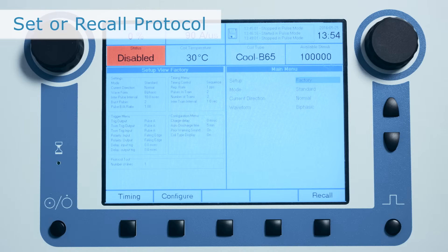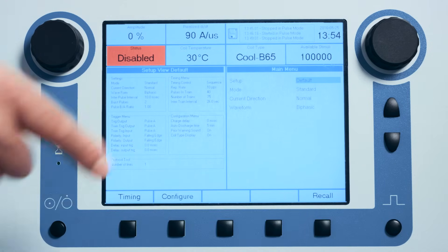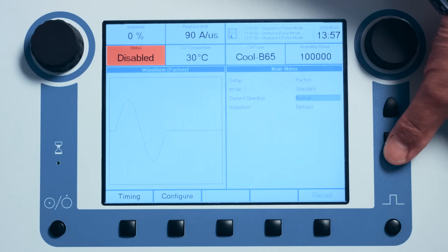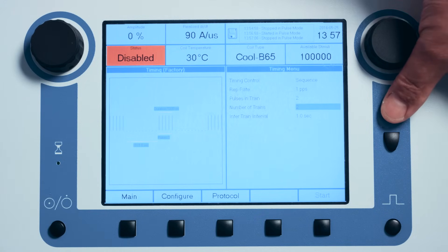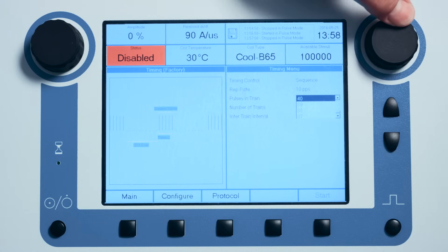If the stimulator does not boot up with the default protocol loaded, one can either recall it or define it again. To recall a protocol that has previously been defined and stored, from the main menu use the pulse wheel to select the protocol to recall, then depress the Recall soft key. The recalled protocol is now loaded and information about it is displayed in the setup view window. To define a protocol manually, confirm that the mode, current direction, and waveform are set to the correct values for the approved RTMS depression protocol. The stimulator should operate in standard mode with a normal current direction and with a biphasic waveform. Navigate to the timing page, set the actual protocol using the arrow buttons and pulse wheel, and set the timing control to sequence. The rest of the protocol settings are defined according to the user guide.